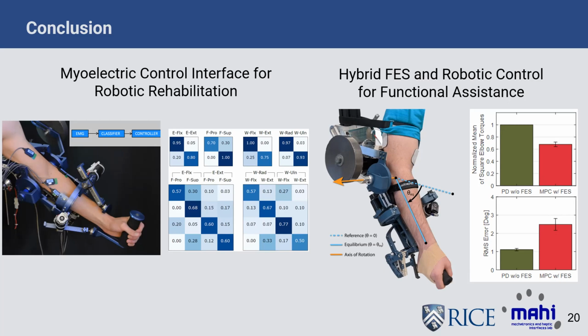Certainly something that needs to be accounted for in the future. For example, in my study, which is the hybrid FES and robotics, a majority of the experiment is solely based on the calibration. But yes, it is a big challenge that's faced in these topics of research.